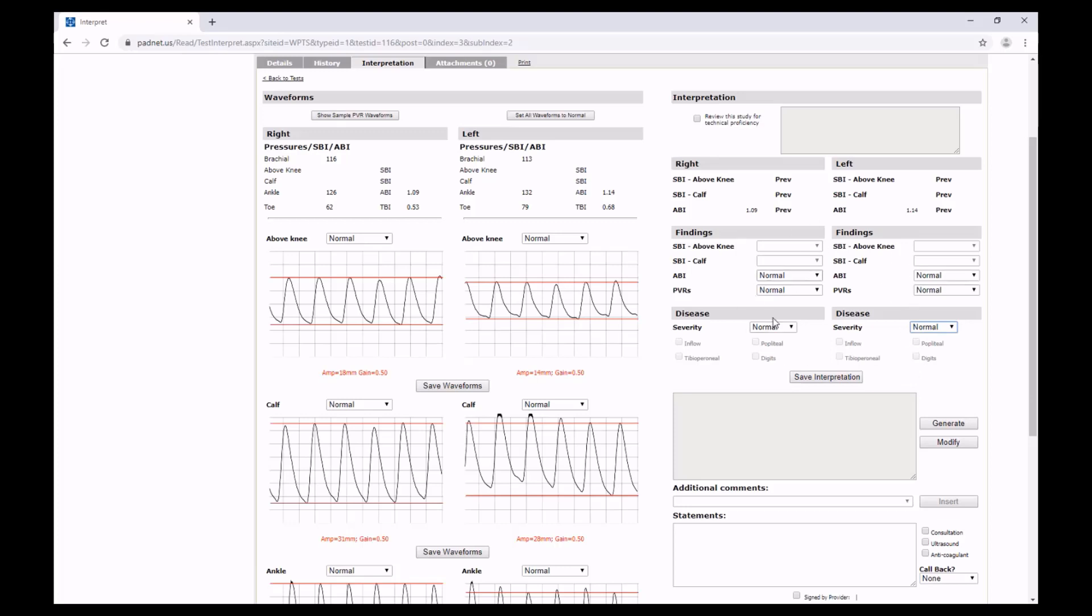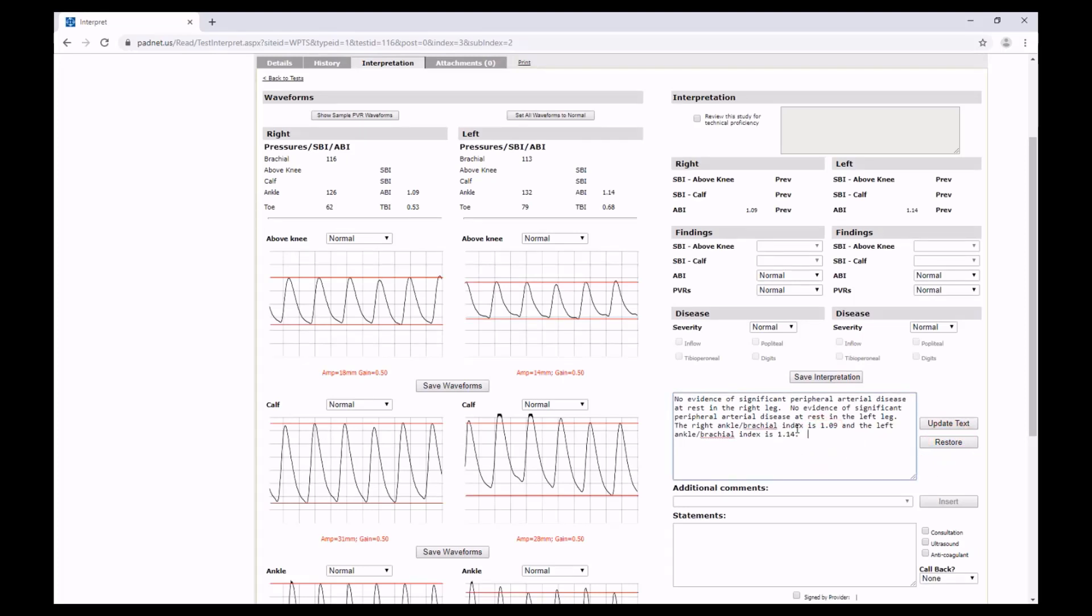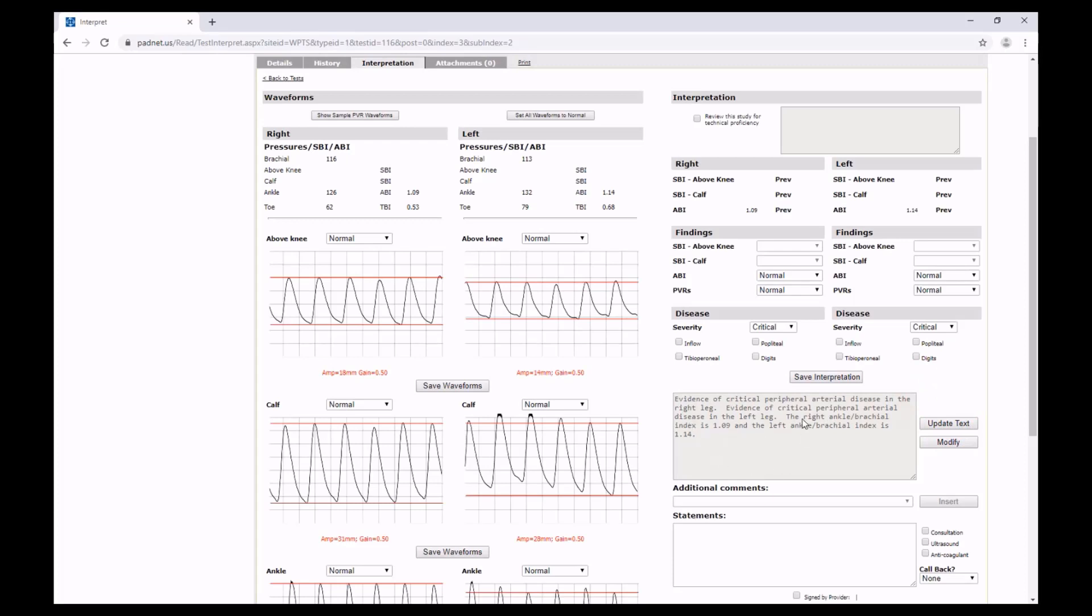Once we've selected all of these ratings, we can generate the text for an interpretation. This text box will appear where it will say a summary sentence describing the general condition and severity of PAD, as well as a summary of the ABIs. If we wish to update or edit the text, we can hit Modify, make any amendments we'd like. Once we're happy, we can hit Restore. And if at any point we change our ratings, we can update and the automatically generated text changes.